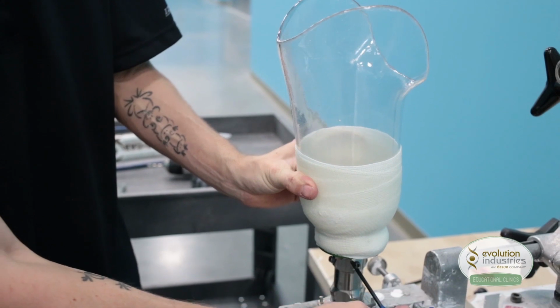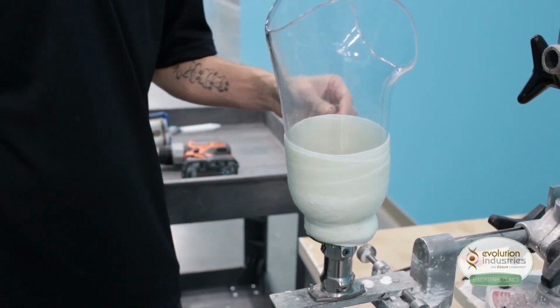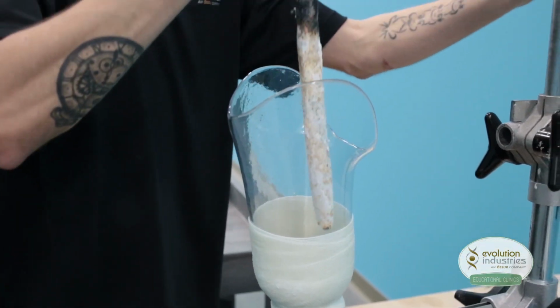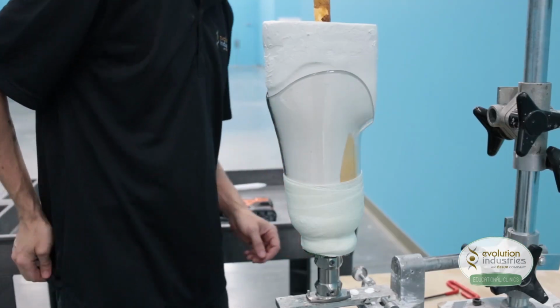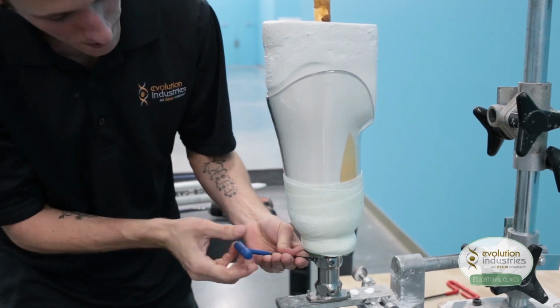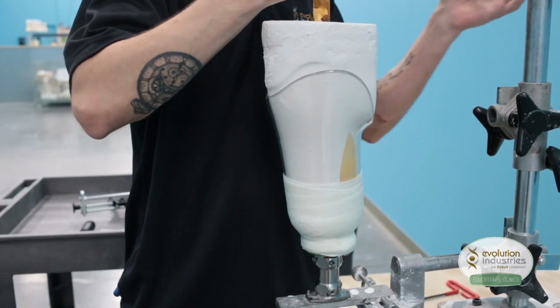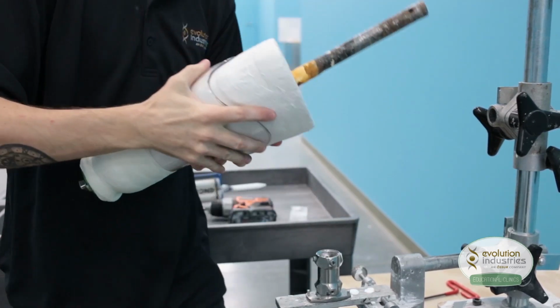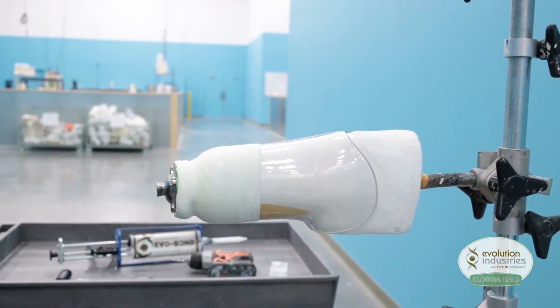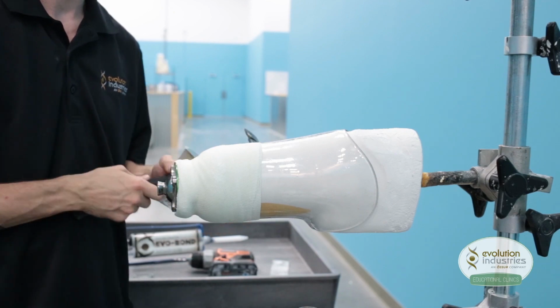Return the check socket to the alignment jig. And then we will pour our plaster to capture the alignment. Once your plaster is set, you can remove the check socket from the alignment jig. You want to loosen only 2 screws to keep your alignment. And then you'll remove your check socket from your plaster mold. If it's contoured nice enough, sometimes you can use an air hose and just pop it off.